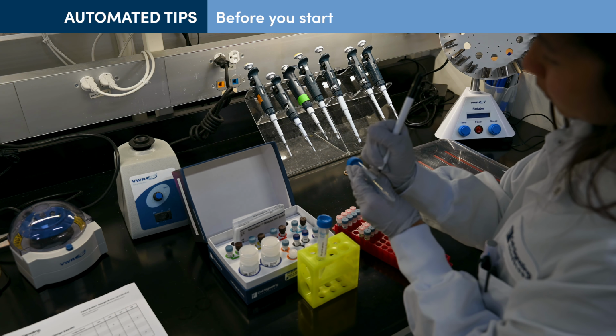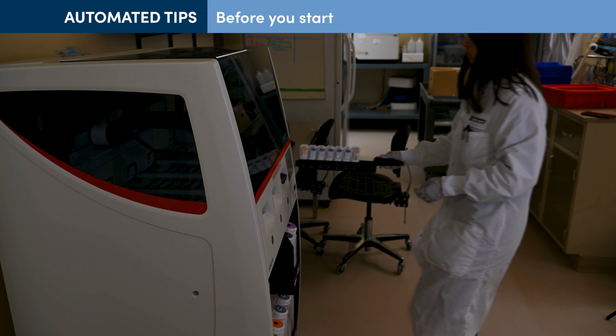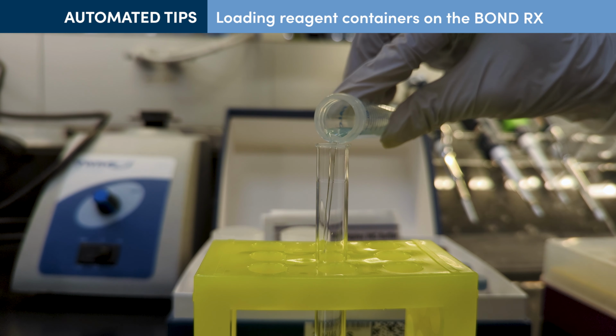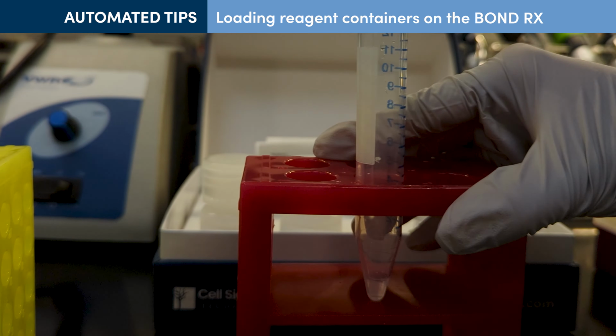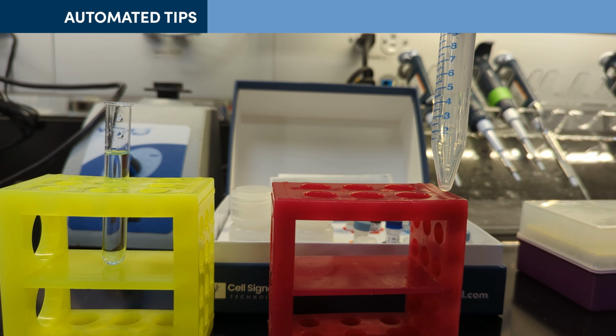We recommend making reagents fresh and loading them onto the Bond RX once they are prepared. You can start the staining run immediately. The slides may sit after staining is completed, but we have found no effect on staining quality if they are imaged within 8 hours. Instead of transferring amplification solutions by pipette, pour the amplification solutions directly from the 15 ml conical tube into the Bond RX titration tube. Recap the tube and let it stand upright for a few minutes to allow the solution to collect at the bottom of the tube. Then pipette the remaining solution and add to the titration tube.